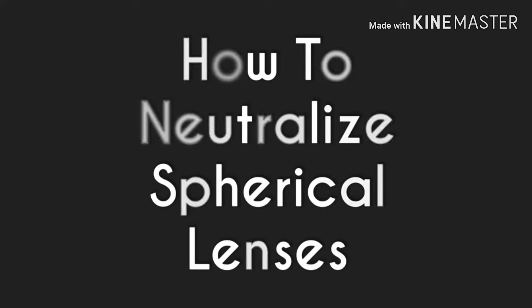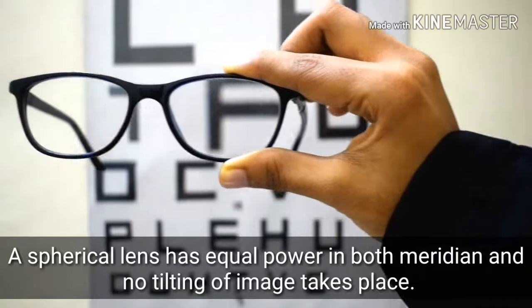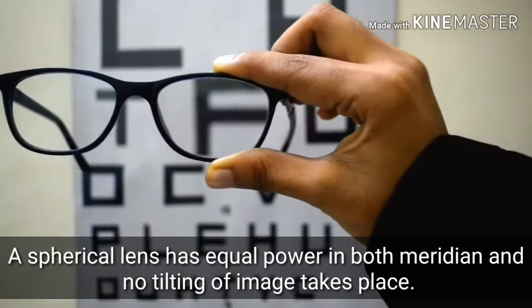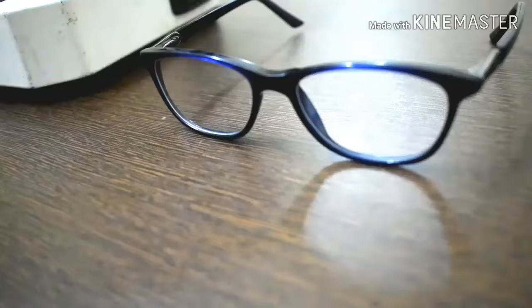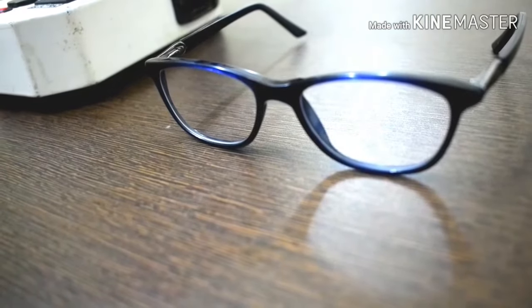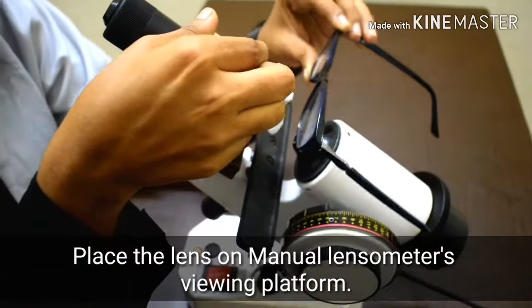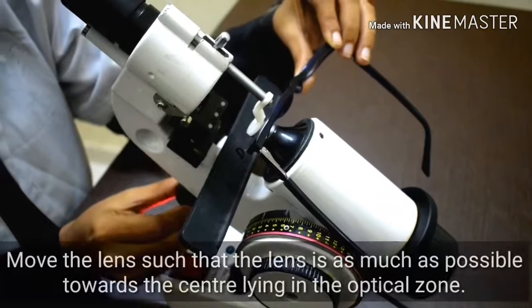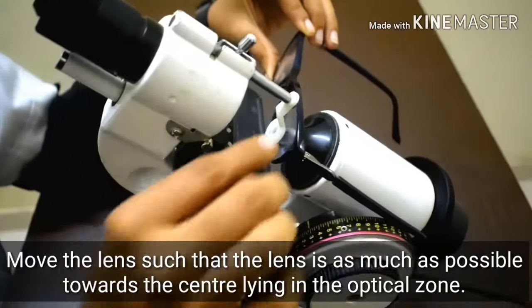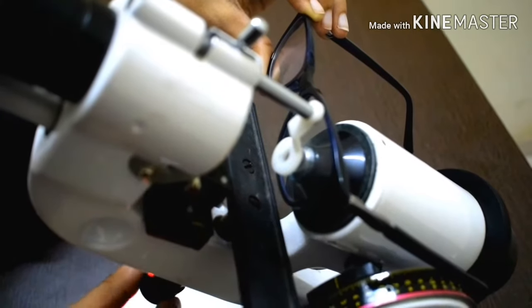How to neutralize spherical lenses. A spherical lens has equal power in both meridians and no tilting of image takes place. Place the lens on the manual lensometer's viewing platform and move the lens such that it is as much as possible towards the center, lying in the optical zone.